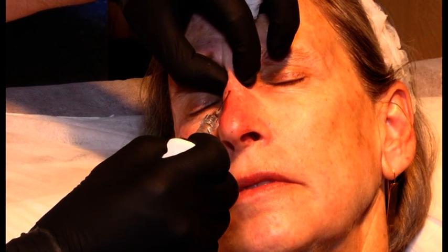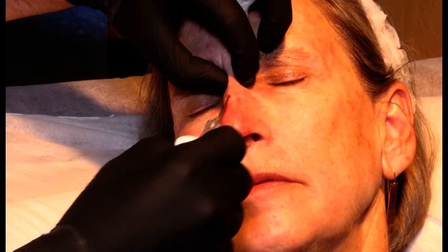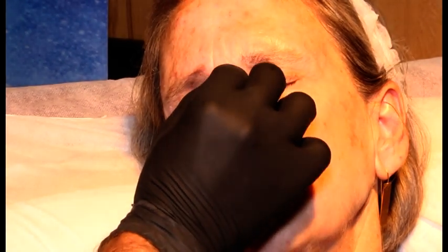So, as you can see, I'm taking a long time to inject 0.2 cc's of product. Now, looking from the side, you see that it's starting to improve already, right? The ideal location of the nasofrontal angle is at the supraciliary line. So don't continue too far up, because then you will start to make a Greek profile, which is not very aesthetic. You have to know when to stop. You have to feel when to stop.